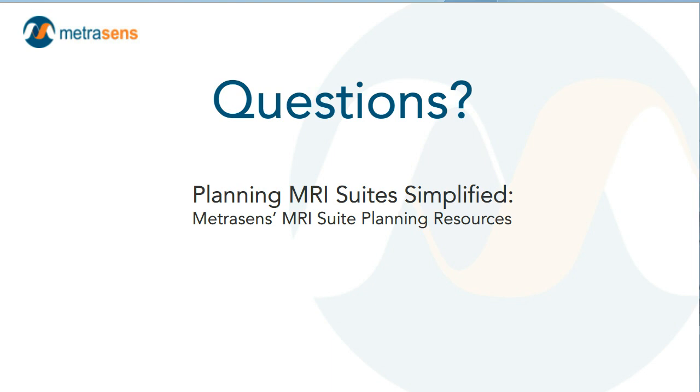This could be its own webinar. I'll speak to the United States. In the United States, we have two different general classifications of accreditation. There is enterprise level accreditation that is generally required of hospitals. Joint Commission is probably the enterprise level accreditation organization that most people are familiar with. The other classification or grouping of accreditation is modality level accreditation.